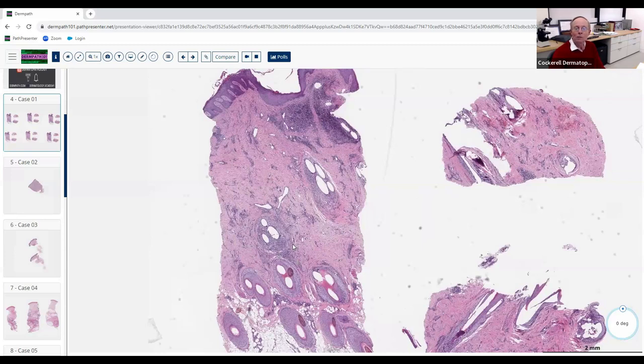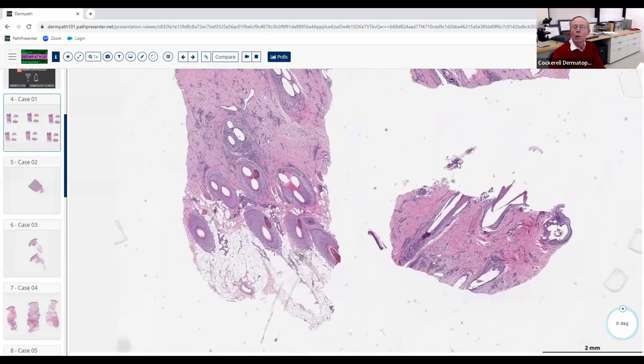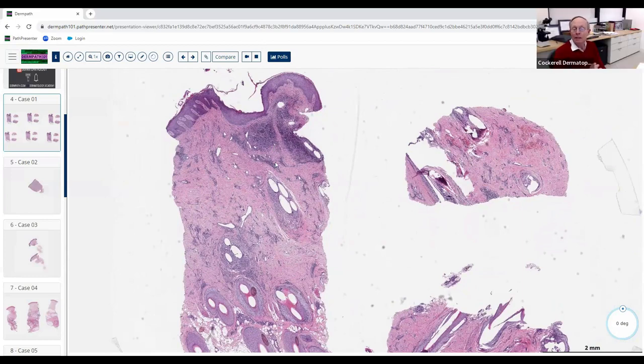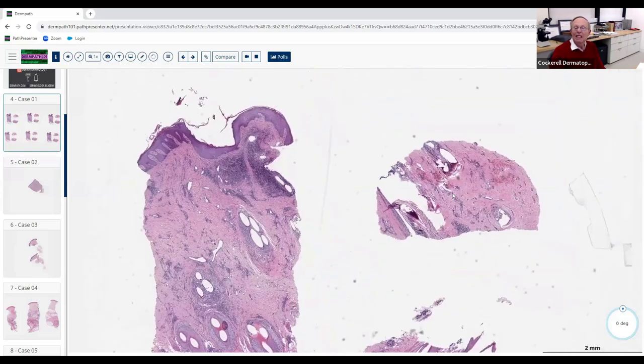Also notice there's a minimum of sebaceous lobules, which would favor the scalp over the face or beard area. Notice how this biopsy was processed — there's a tear here, not the world's best microtomy. What they did was cut at different angles. We recommend two punches: two 3mm punches — one for vertical orientation and one for horizontal orientation.